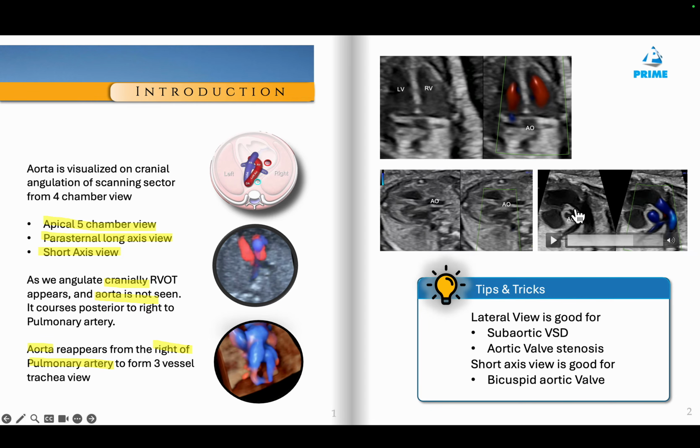So that's where, on a cross section, you see, again I'm repeating, a perimembranous VSD close to the tricuspid valve, right in the middle of this right ventricle. Then this is an outflow tract, where this outflow is starting just close to the pulmonary valve. So you get a subpulmonary, perimembranous, outflow VSD and subpulmonary VSD.